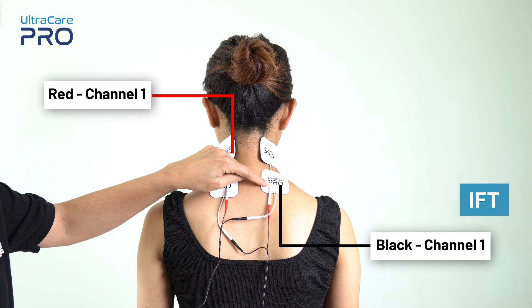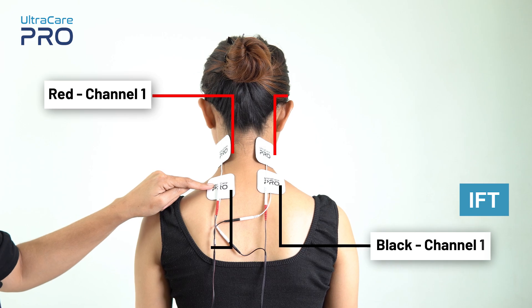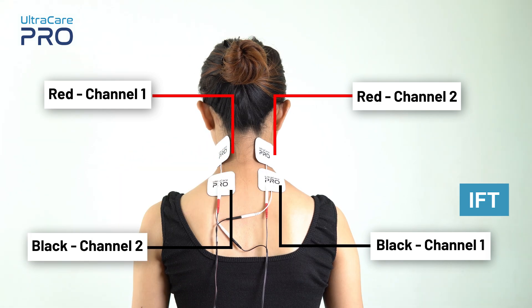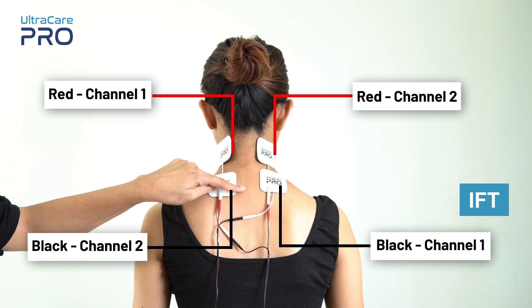For IFT application, place the red and black electrode from channel 1 diagonally opposite to each other. Similarly, place the red and black electrode from channel 2 diagonally opposite to each other, in a way that they form a cross pattern and cover the painful area. Make sure not to place any of these electrodes over the bony areas of the spine.